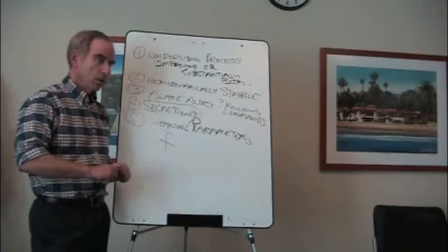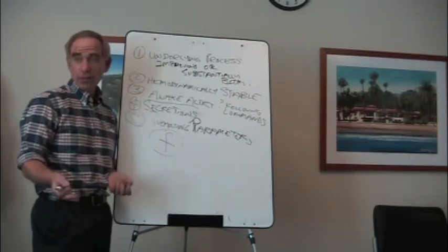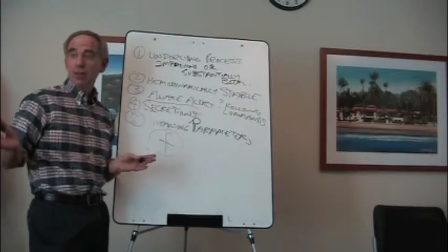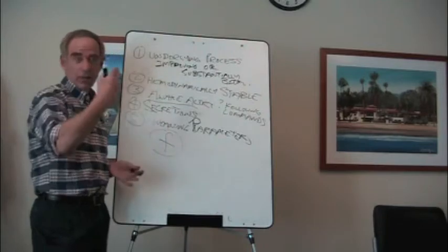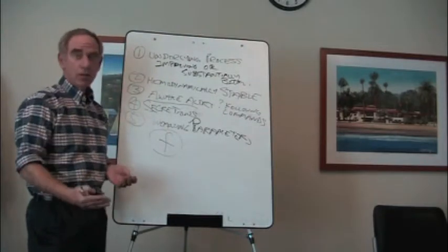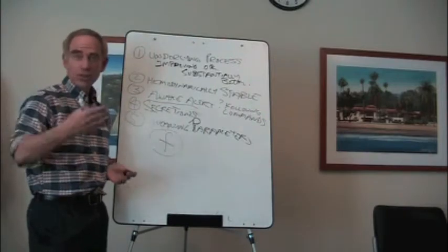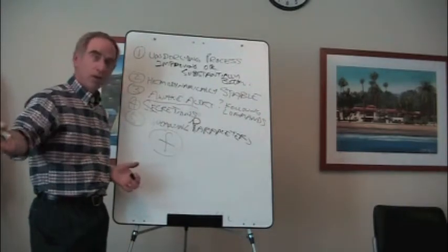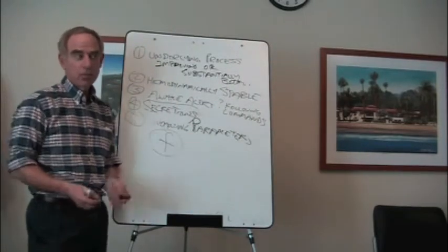Okay, so frequency or rate is really critically important. In fact, rate integrates everything. It integrates the chemoreceptors, the respiratory muscle function, the resistance, the secretions, bronchospasm, all the resistance stuff, all the compliance stuff, and gives you the balance between those two.